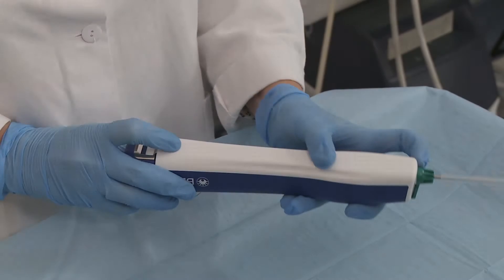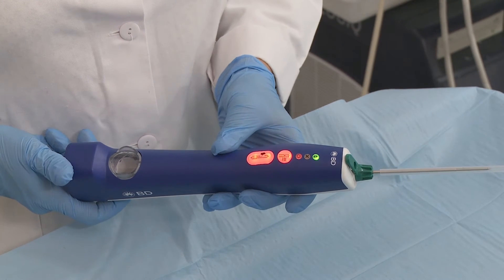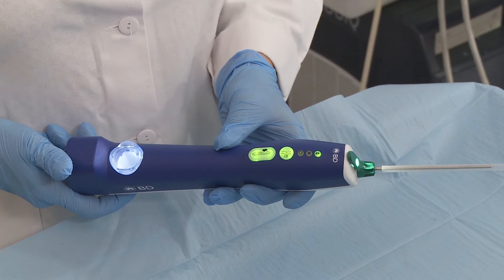Once the probe is attached to the driver, the sample button flashes green. Touch it to synchronise the probe with the driver. The device is ready to use.